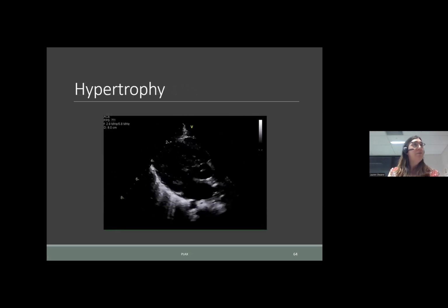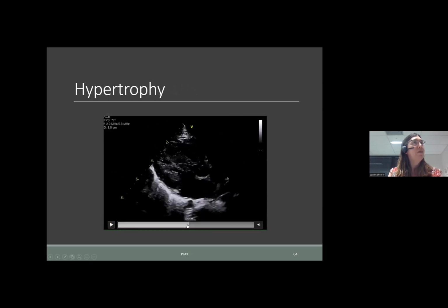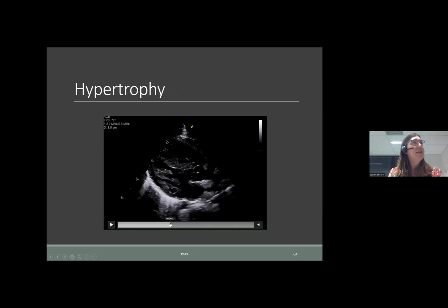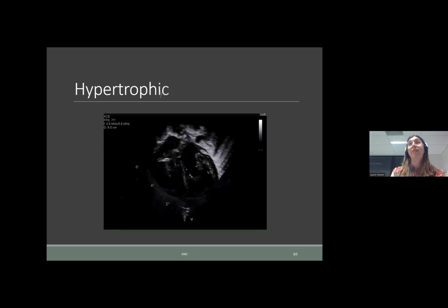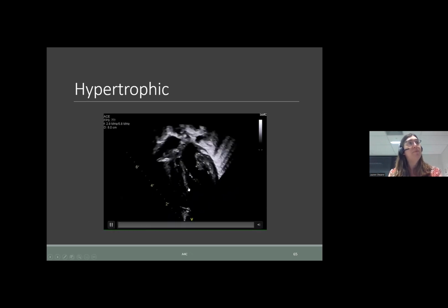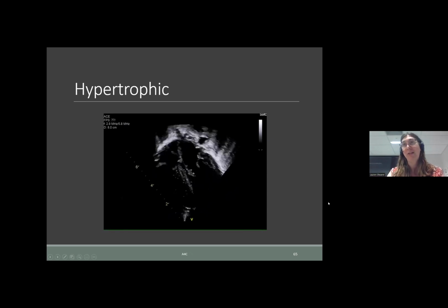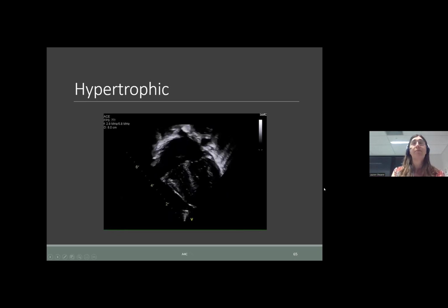Now, lastly, just a few pictures of one of my patients. This is cardiac hypertrophy, and this is from that long axis where previously we had nice thin myocardium on both sides. Here we've got a big bulk of muscle in the middle. Particularly in the more adult patients, that hypertrophic cardiomyopathy can be from a vast variety of things, but is often associated with dysfunction. Now, this child's heart actually squeezes relatively well, but we've got that big bulky septum, and that actually gets in the way and can cause murmurs and obstruction and make you quite unwell.